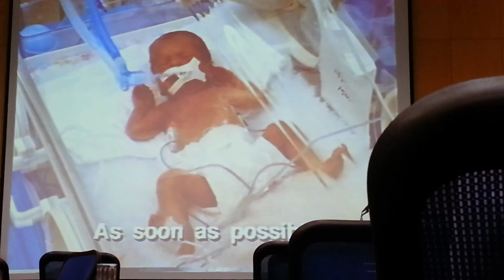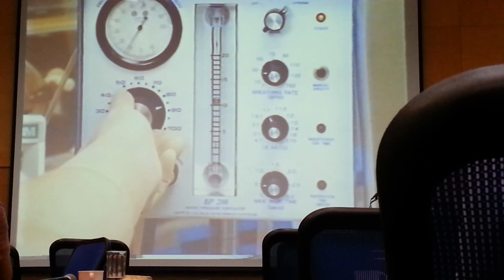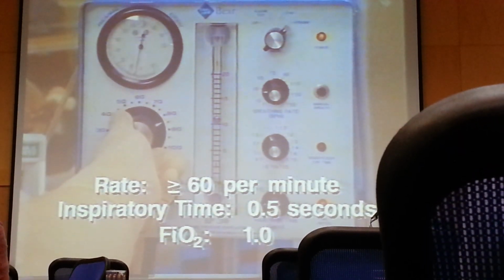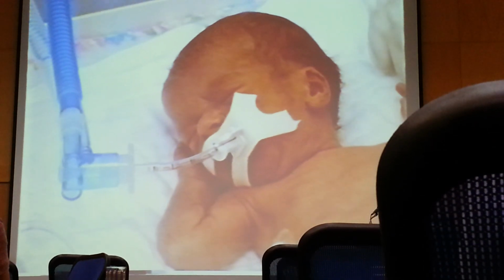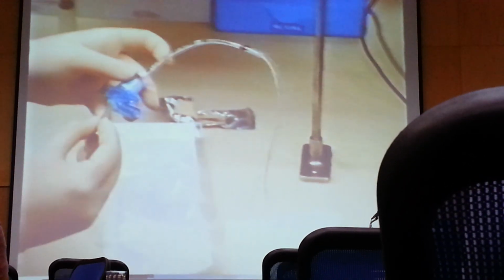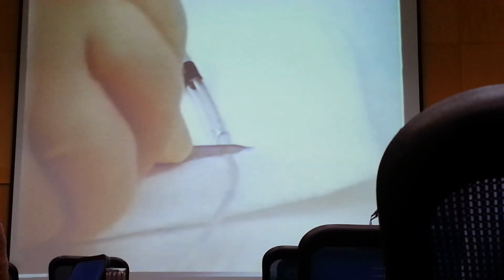Infants should be treated as soon as possible after being placed on a ventilator. Adjust ventilator settings during the procedure. For dosing through a neonatal suction adapter, prepare a syringe, a duplicate endotracheal tube, a 5 French end-hole feeding catheter, a sterile cutting tool, and a vial of Surfactant warmed to room temperature. Cut the catheter to match the combined length of the endotracheal tube and adapter.